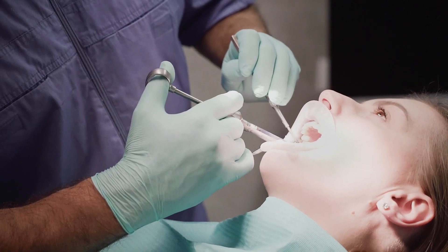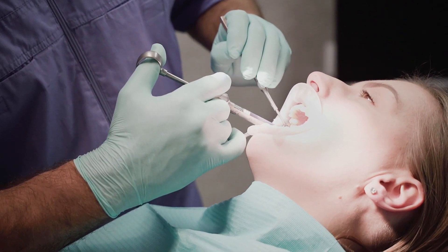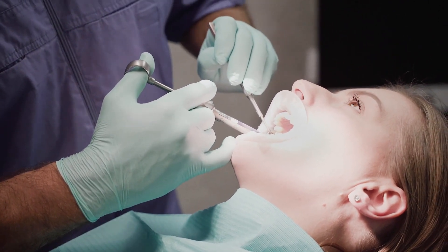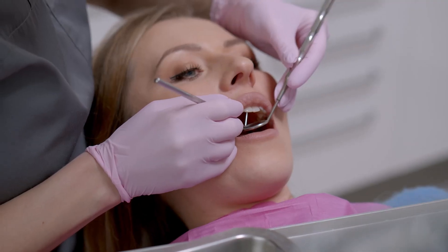The inferior alveolar nerve block is one of those things that I remember as a student — it was like: I'm going to try this, I don't know if it's going to work, and sometimes you can just be guessing where you're going to inject. With a few years of experience, I think I've worked it out and I manage to get my blocks to land 95% of the time. Sometimes you miss them, and more often than not it's because of anatomy — that person might just have slightly different anatomy.